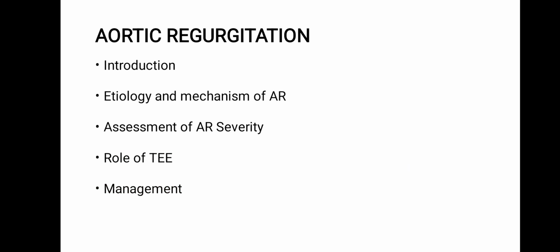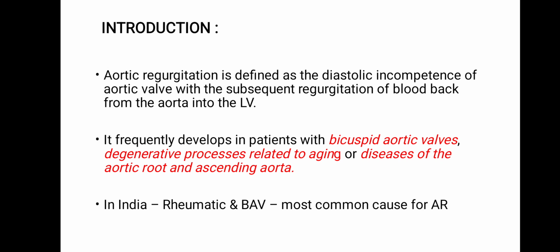These are the notes which help me in my DNB final exam. Aortic regurgitation is defined as the diastolic incompetence of the aortic valve with the subsequent regurgitation of blood back from the aorta into the left ventricle.